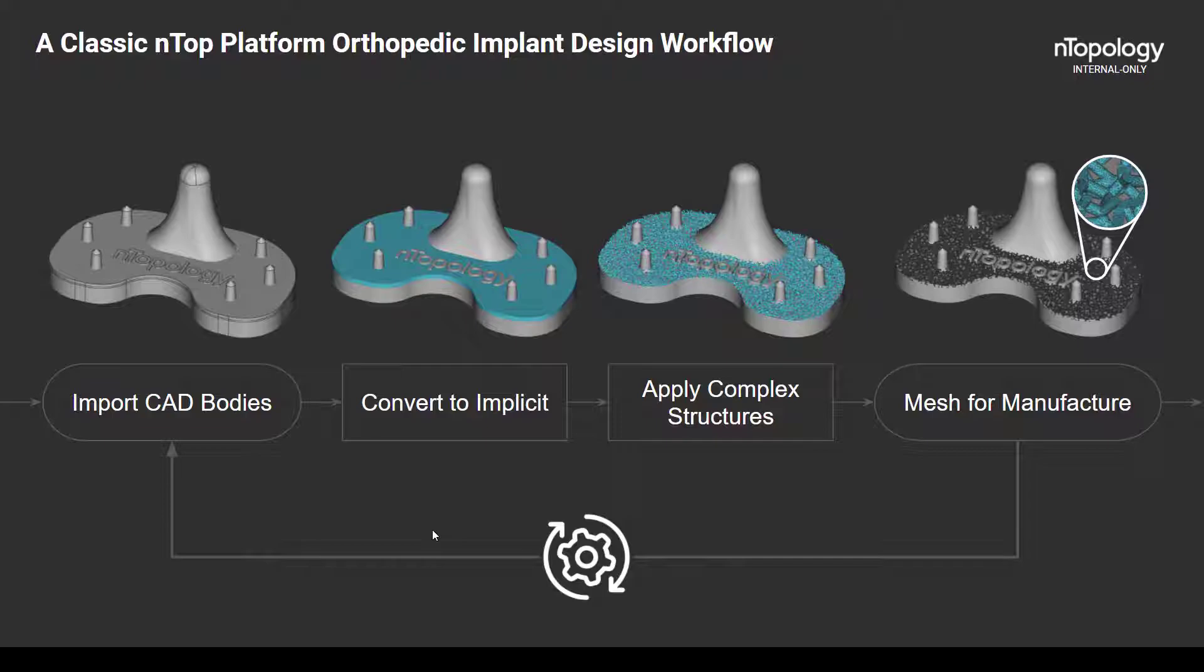From there, it's just a matter of applying your complex structures, in this case, applying your osseo-integrative lattice, and then ultimately meshing the result into an STL file so that you can finally print your parts.